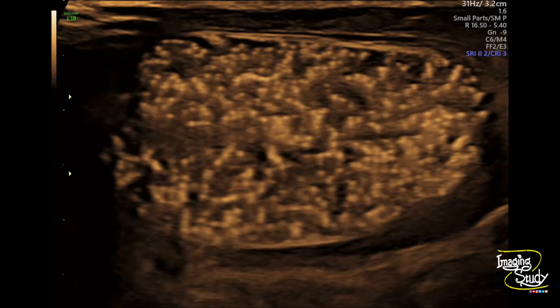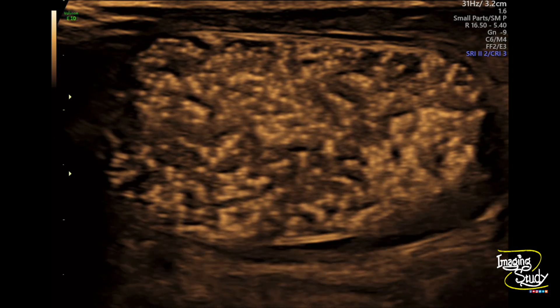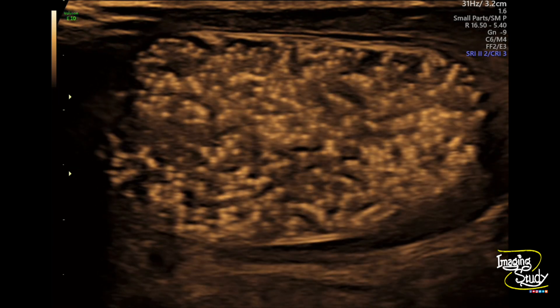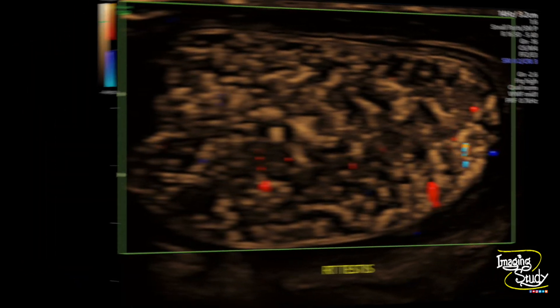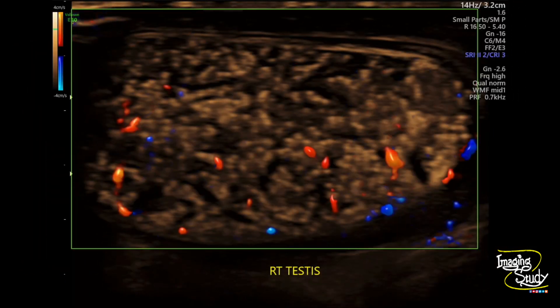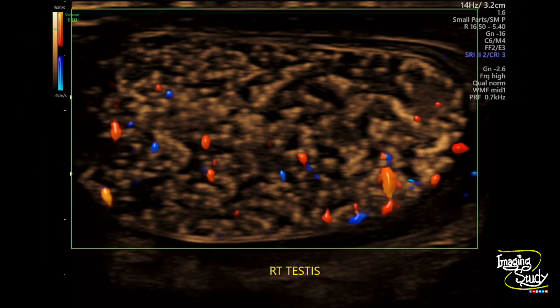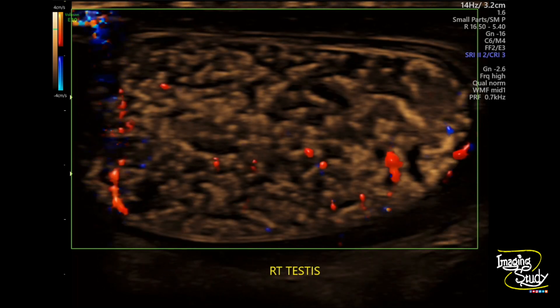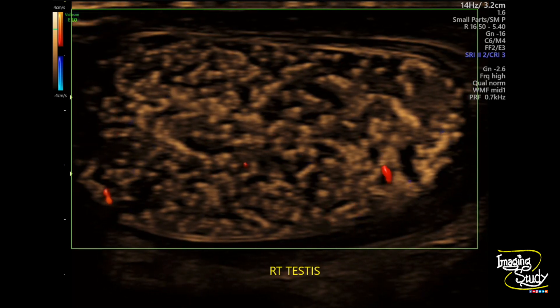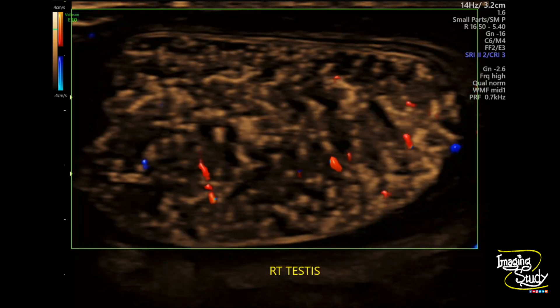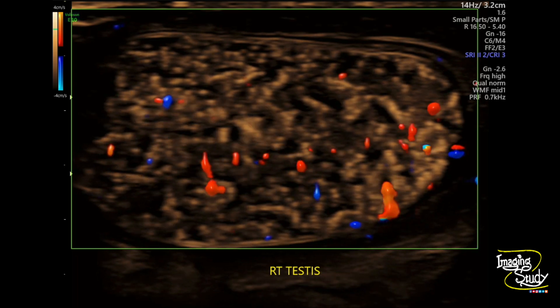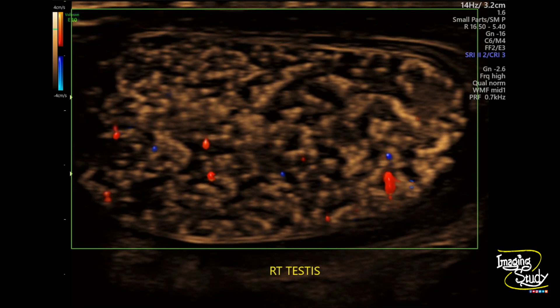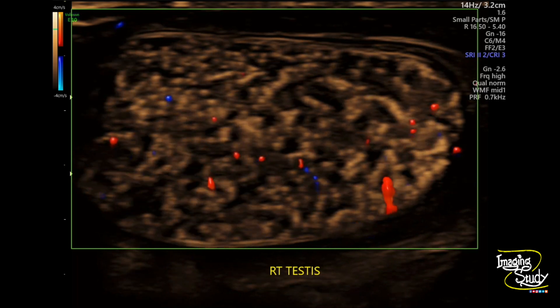Here's a magnified view of the right testis with diffuse microlithiasis. Now we have put color Doppler on the right testis and you can see normal vascularity. We have adjusted the pulse repetition frequency, or PRF, to ensure the view of enough vascular flow within the testis so that we can compare it with the left one.